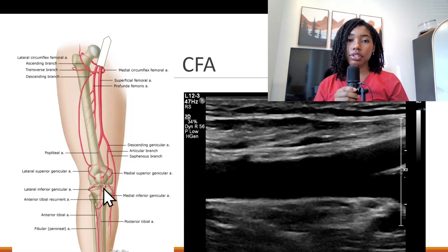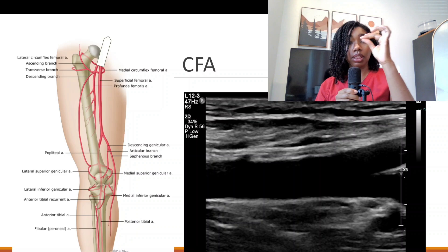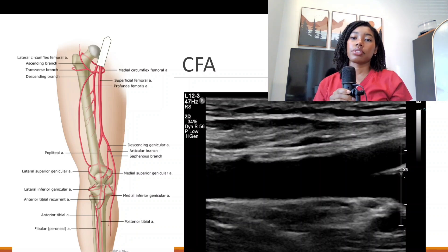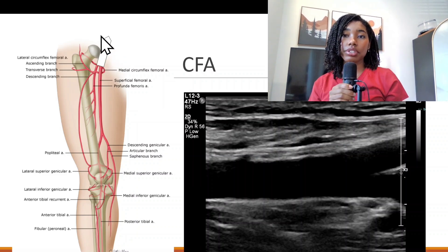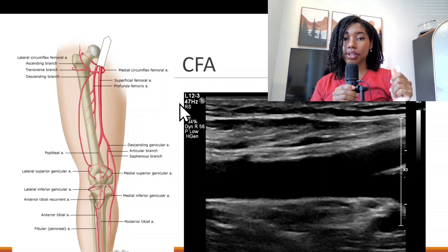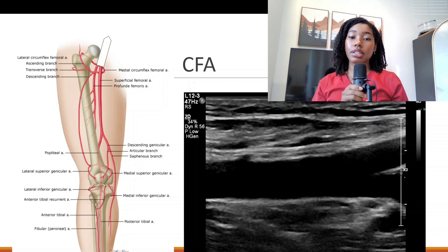Let's get started with our first image: the common femoral artery. The common femoral artery is always lateral to the vein — do not image the common femoral vein as the artery. Make sure you find the artery that is pulsatile, where the walls are more defined, and check the arterial pulse wave signal. In this diagram, the arrow corresponds to the transducer direction. Place the transducer high in the groin, and don't be afraid to go way up high — get the patient's underwear out of the way. This is not the time to be modest.